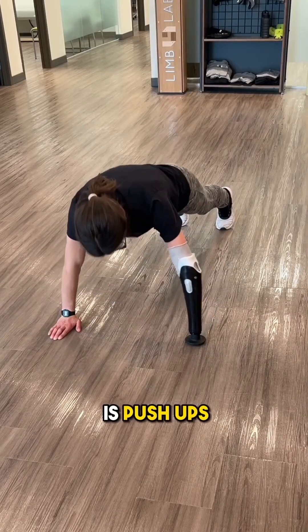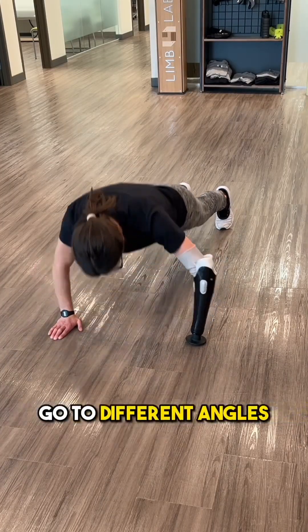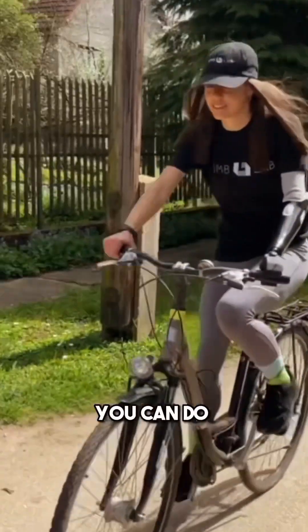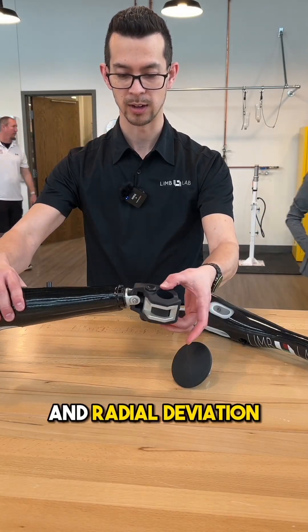One thing Petra does quite a bit is push-ups. She can get on there and give it some push, but also come down and go to different angles. This is also a grasping device, with which you can do various exercises. You've got the ability to have ulnar and radial deviation.